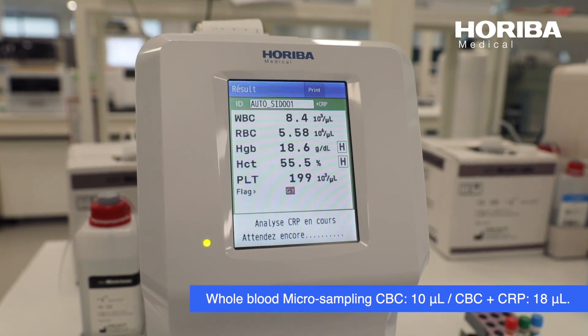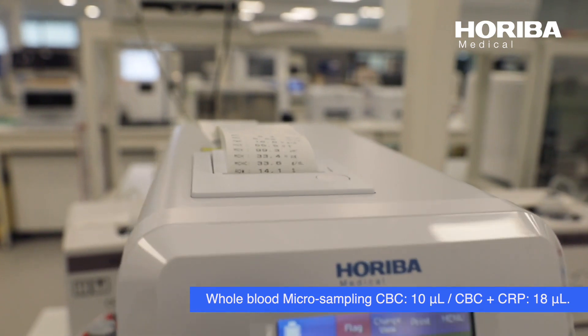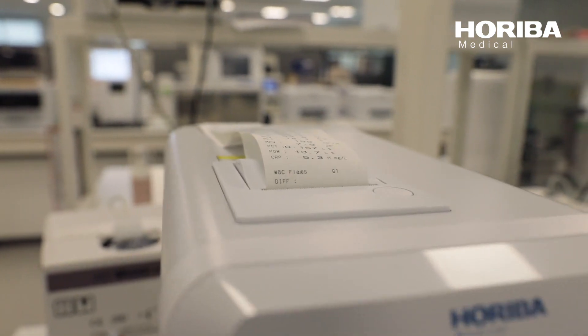Capillary blood micro sampling: CBC requires 10 microlitres, CBC plus CRP requires 18 microlitres.